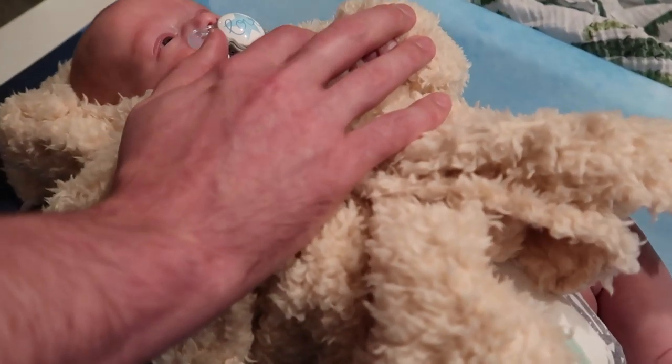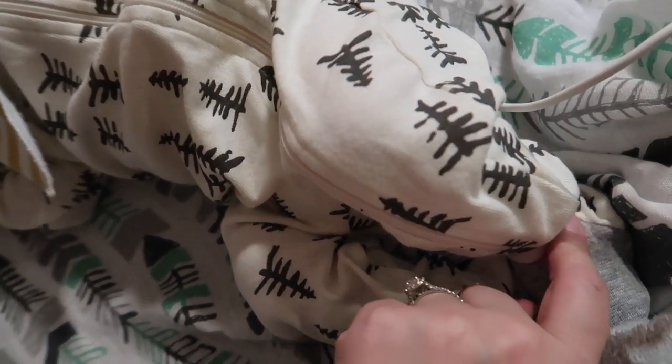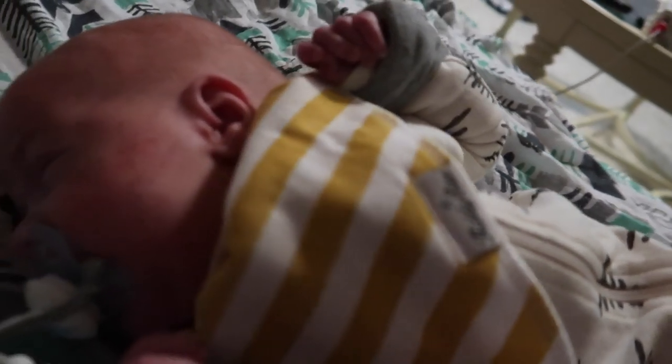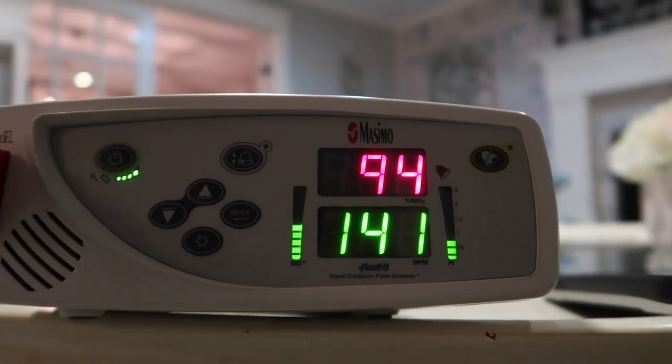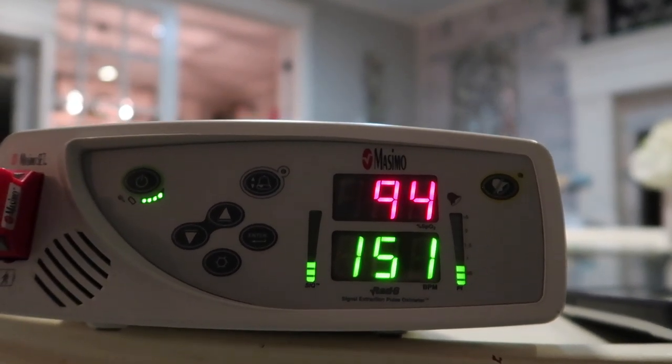Good job Cruz. He's ready to be off that. Cruz is all dressed and clean and we fed his pulse ox monitor cord up the back of his little sleeper. Cruz is still doing great as far as his oxygen saturation goes, so I'm going to leave his oxygen off for a little bit and see how much he can tolerate. The goal is for Cruz to be satting at 94% or higher. If he dips below 94% we start a stopwatch and see if he can recover and go back above 94% within a minute — if he can, that's self-recovery and he can stay off oxygen. He's been doing better than ever today and yesterday, so this really could be it with him being off oxygen.